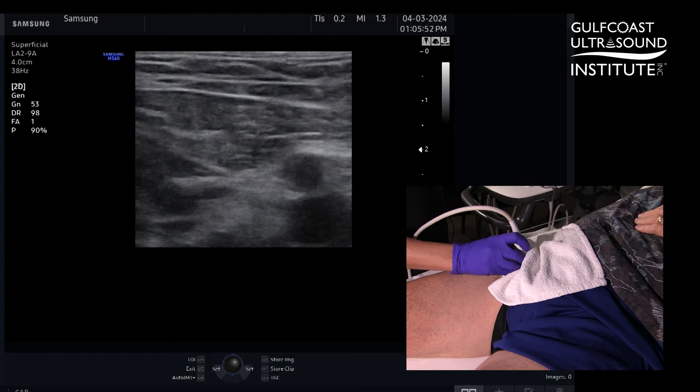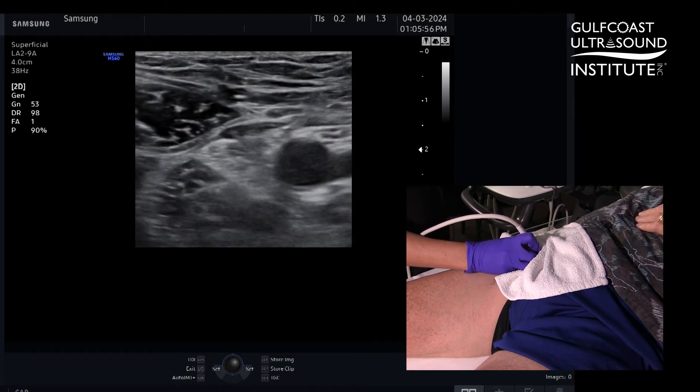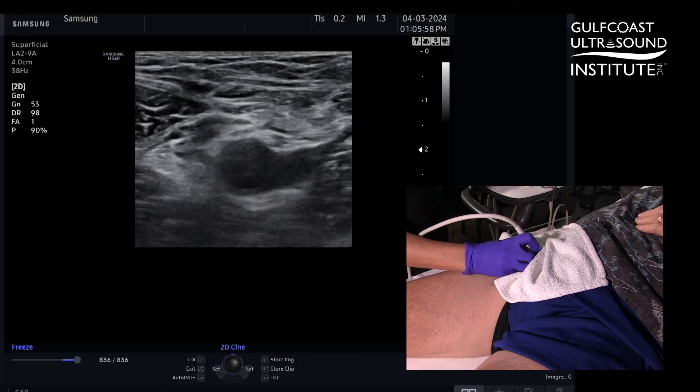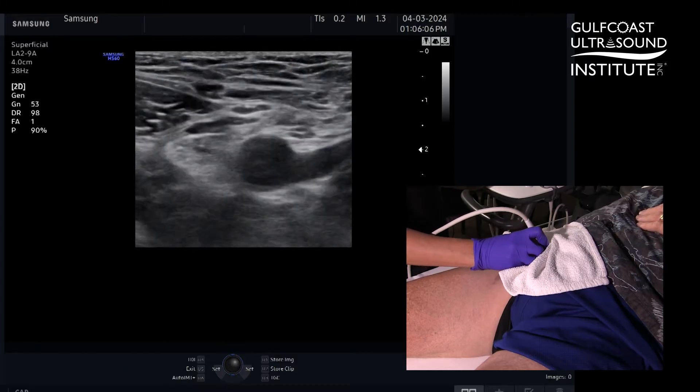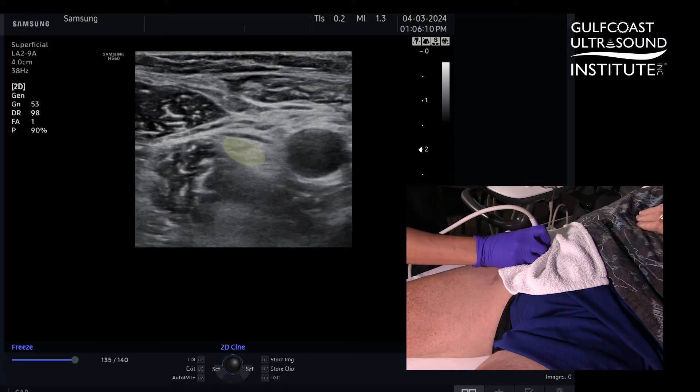Typically you start in the inguinal crease. Immediately you'll find your femoral vasculature — here's your artery, here's your vein.